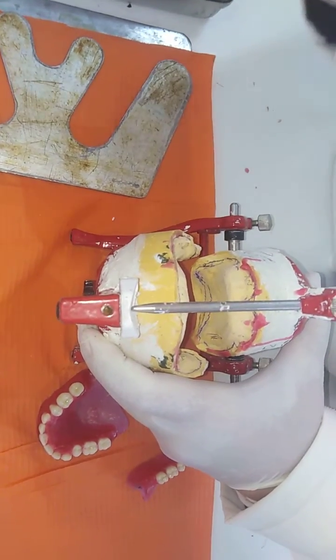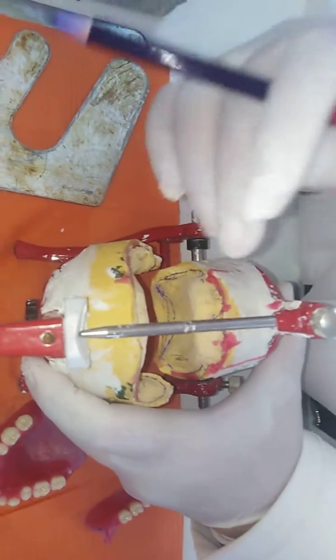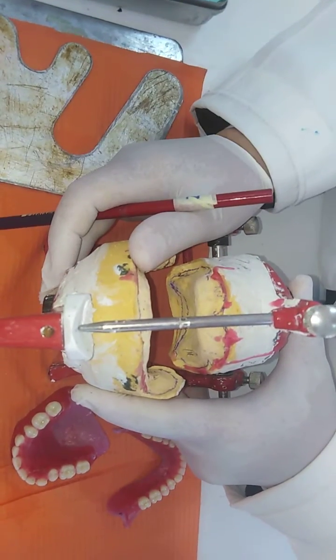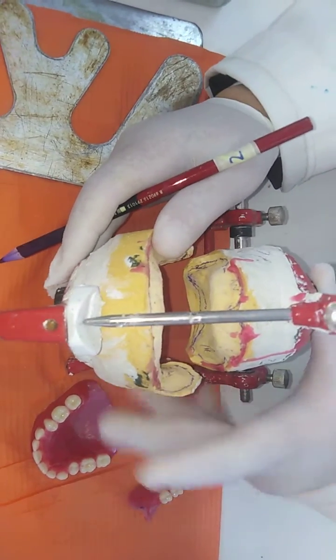So there is a horizontal discrepancy between the size of the maxilla and the size of the mandible. In the other video, we concentrated on the camouflage done in the incisal area. In this case, the technician had done further adjustments and done camouflage in the molar area and camouflage in the number of the teeth. These are the modifications we do in setting in cases of class 3 bone relation.